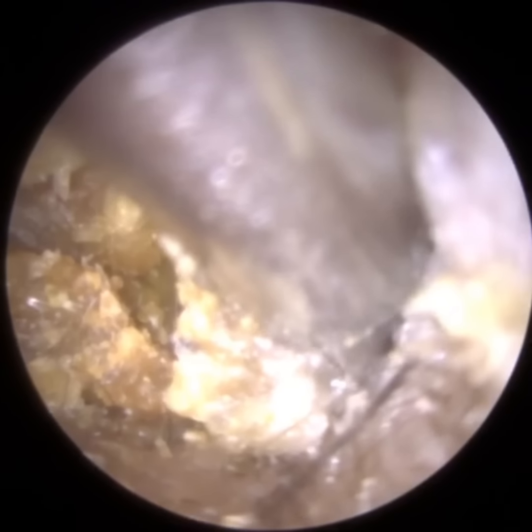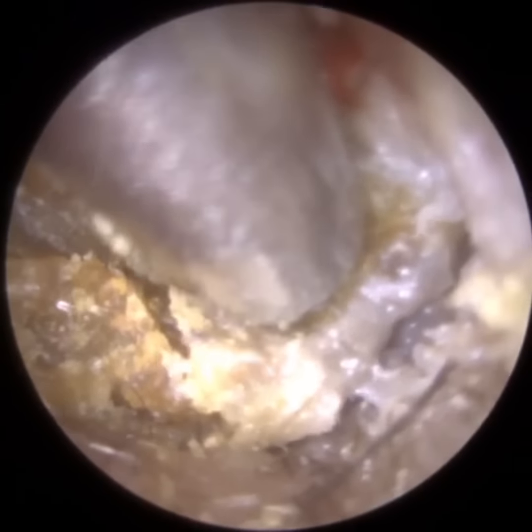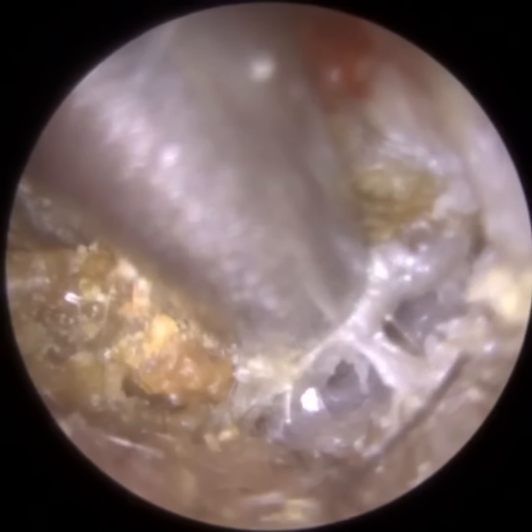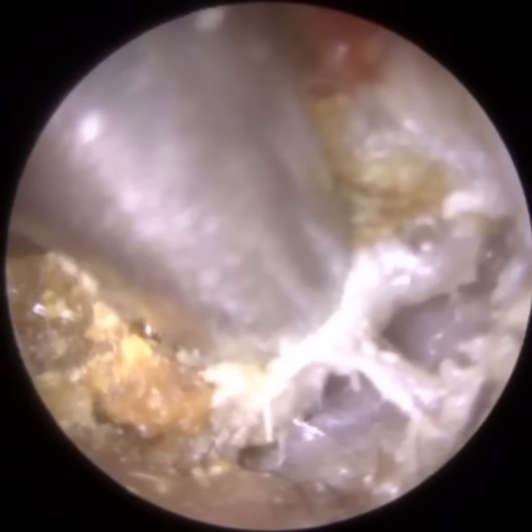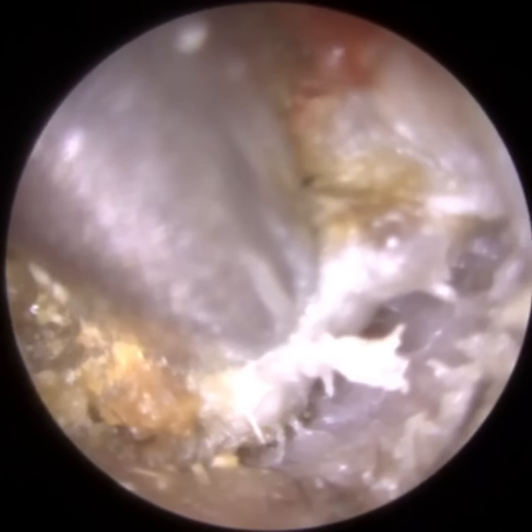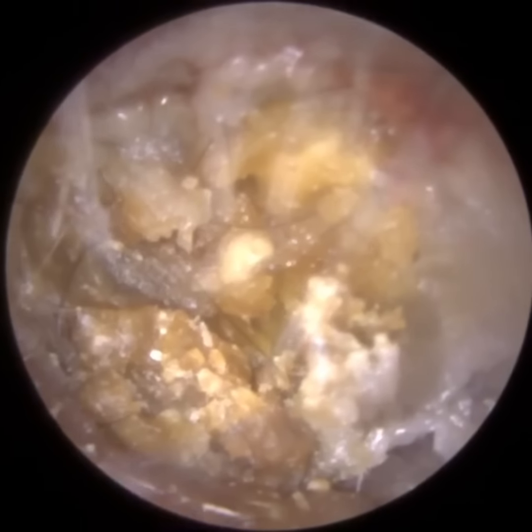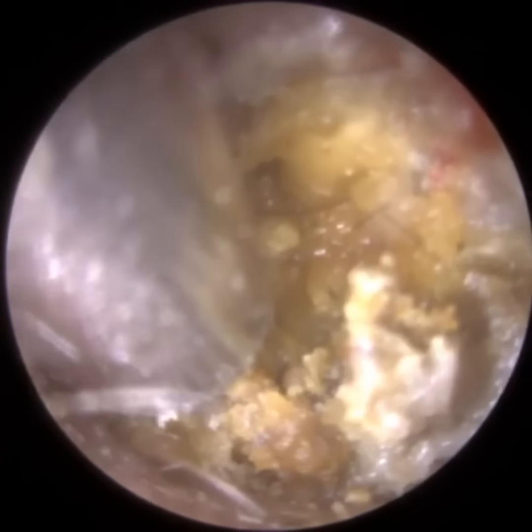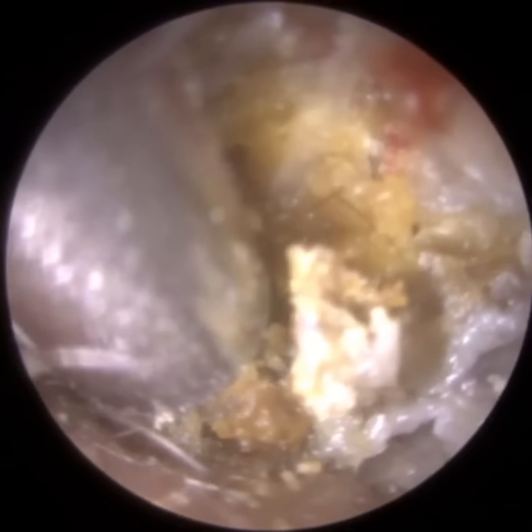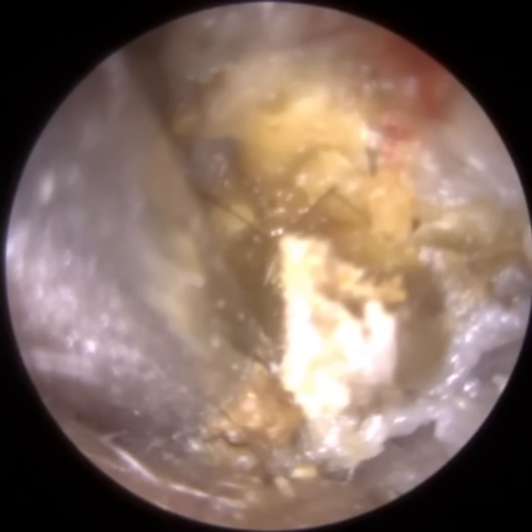I'm just trying to create some space around the edge, because in a moment I'm going to put some sodium bicarbonate drops in. Sodium bicarbonate drops work quite well with dead skin keratin, as opposed to olive oil. If it's earwax, I generally resort to olive oil. I use a spray, but if it's Keratosis obturans or any form of skin, I feel sodium bicarbonate drops work a lot better. It's far more effective.